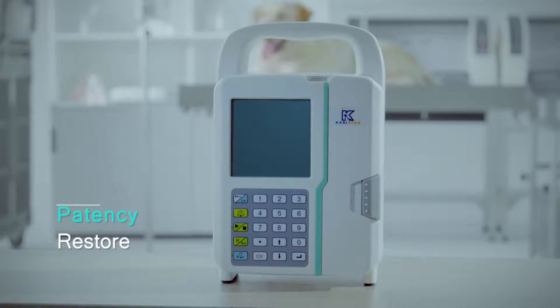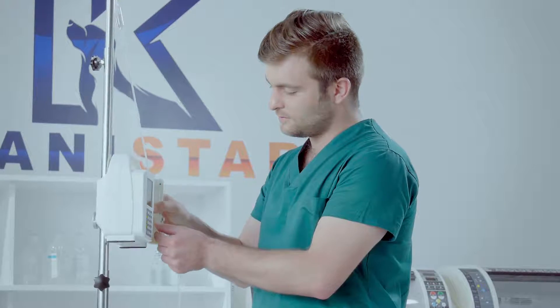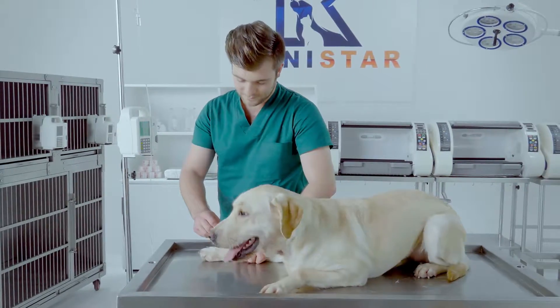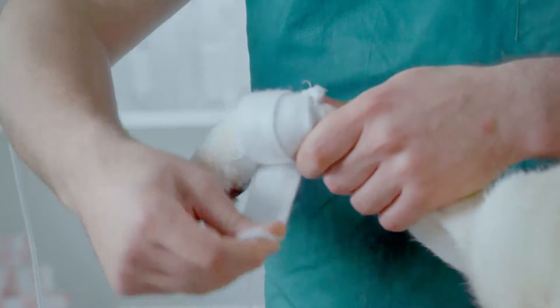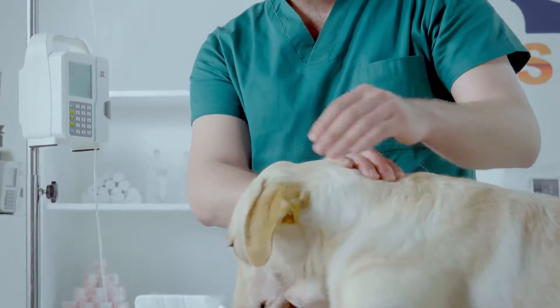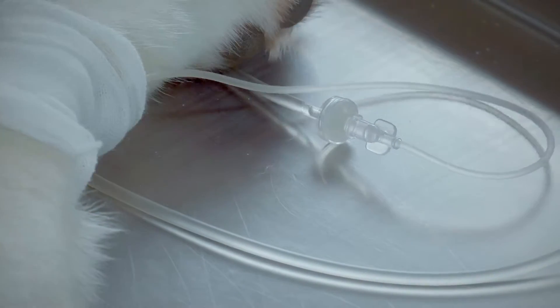Patency Restore. Our operational restoration features are far superior to standard human-orientated pumps, which have only standard blockage alarms. The TransVision LP1900 series features a downstream patency restoring function, which serves animal patients better, allowing for more uncontrolled movements.